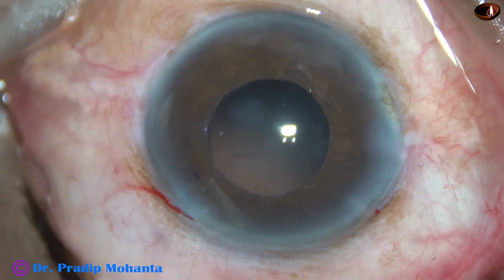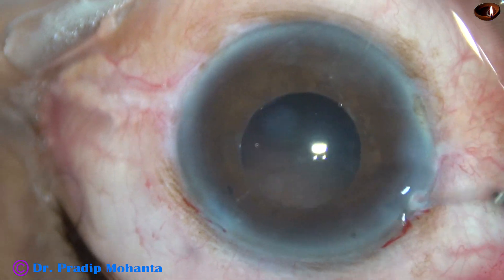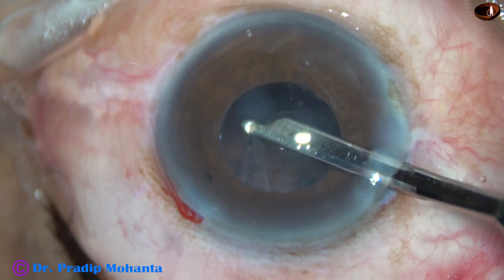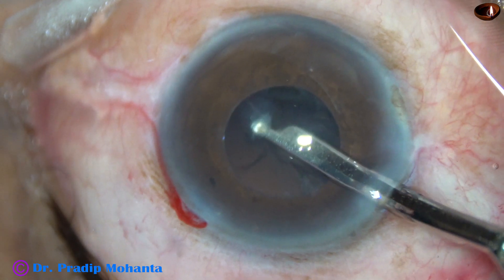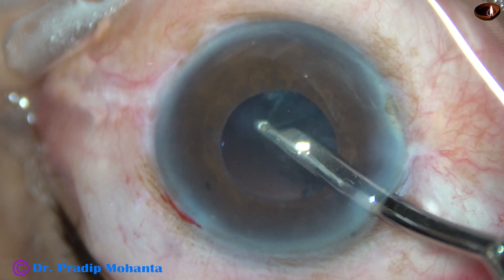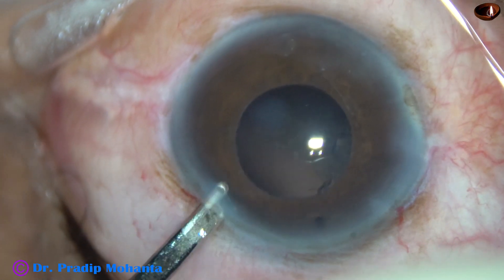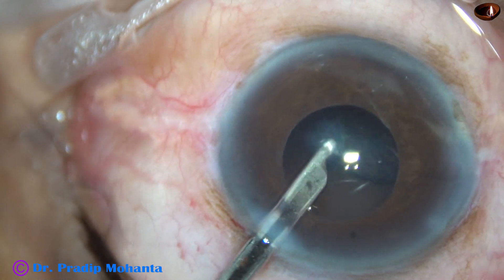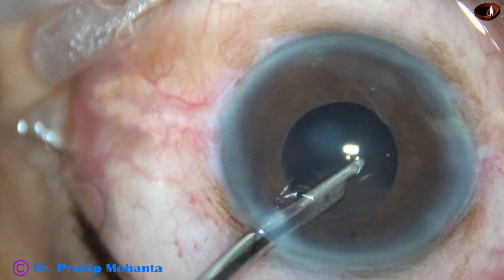Now I inject some more viscoelastic, and I am going to use a 23-gauge Simcoe cannula. This is a very safe instrument — I can use a very low vacuum and pull the pieces tangentially, not centripetally. And I am keeping an eye on the zonule, whether it is giving in, whether the anterior capsular rim is shifting centrally or not. No — it is still fine. So there is no zonule dialysis, just generalized zonule weakness.